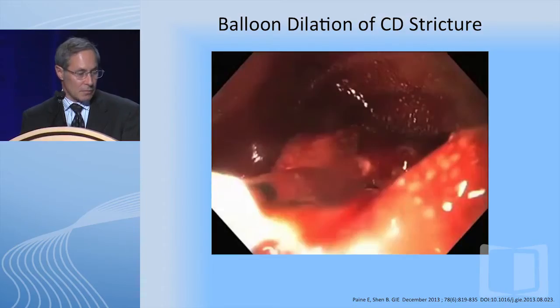Importantly, there was a significant perforation rate, especially in 2 sites who had reports with perforation rates over 10%. They mention that steroid injection and needle knife cut may increase the success in treating recurrent strictures.